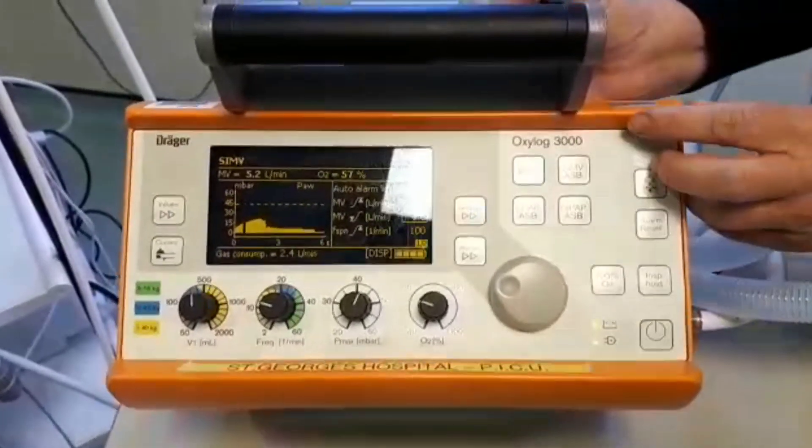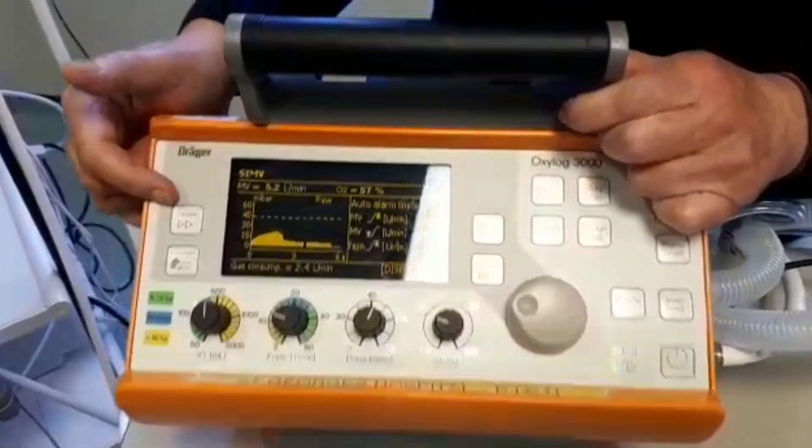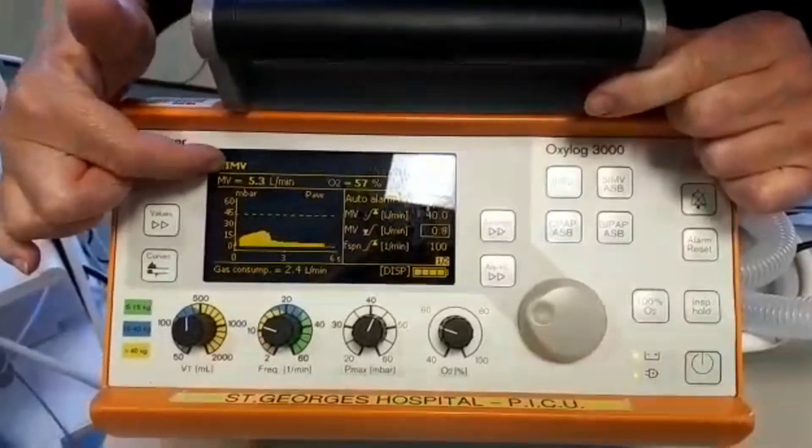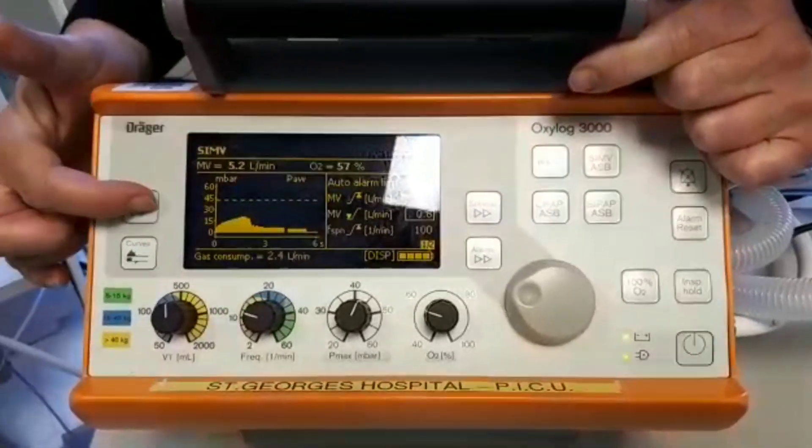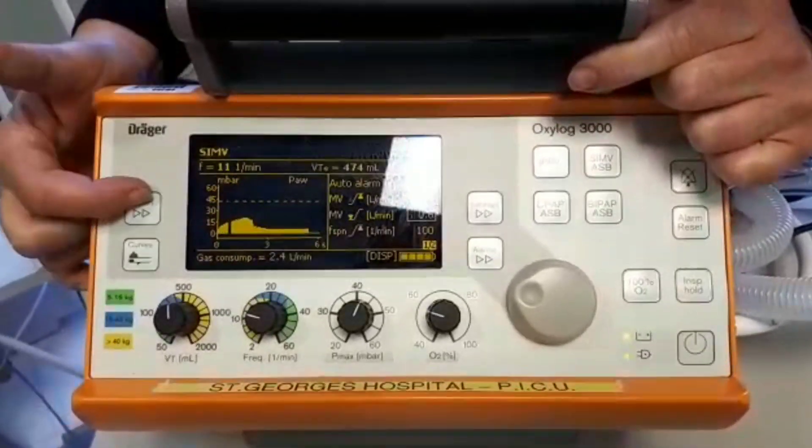Over this side, we have our values button which will display our delivered parameters here. You can only see two at a time, so you need to press the values button to see more.